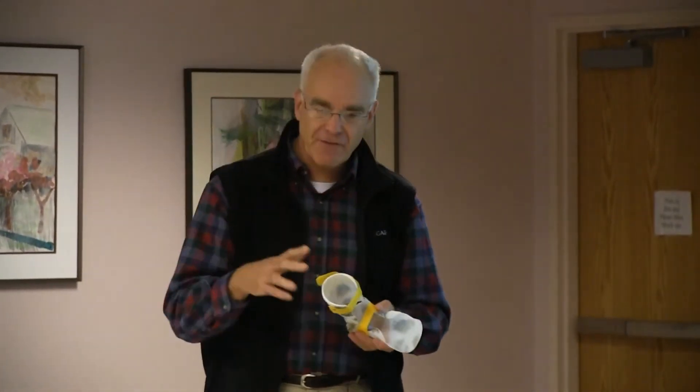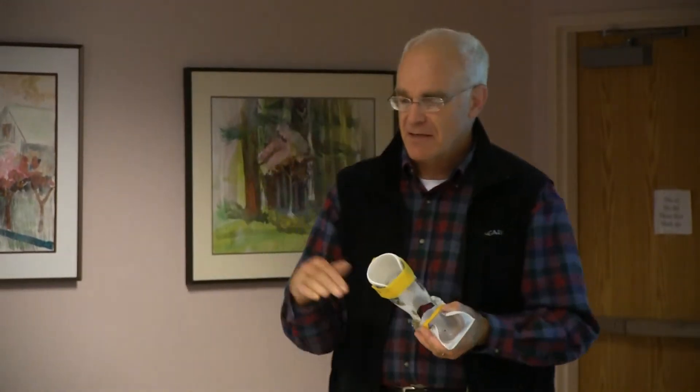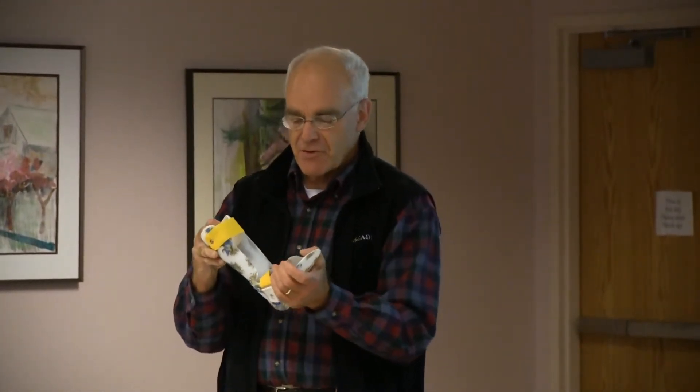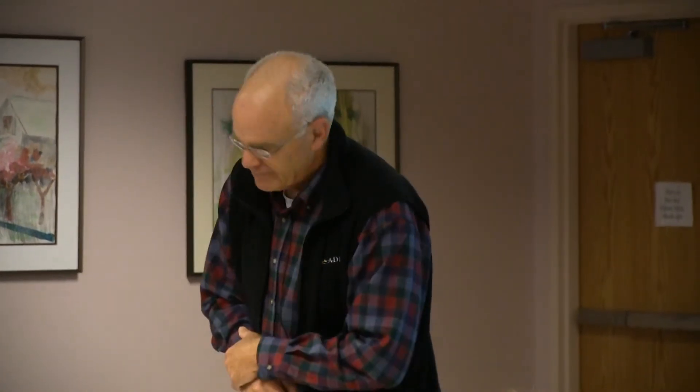In normal gait, we increase our dorsiflexion angle slightly on swing phase to clear the toe — not a lot, but some. The dorsi assist joint, which has a stop, has the pre-bend built into it. Durometer is the density and strength of the material.